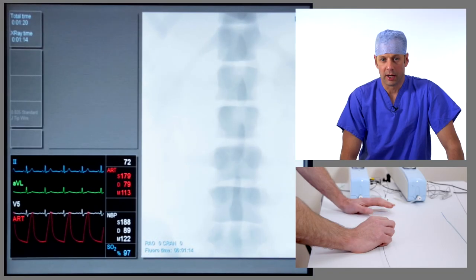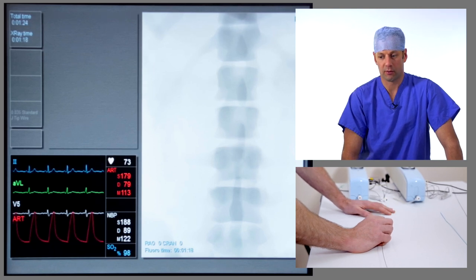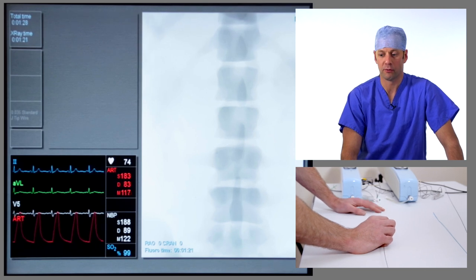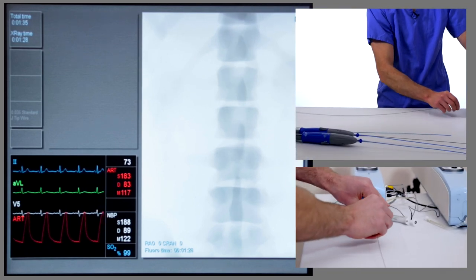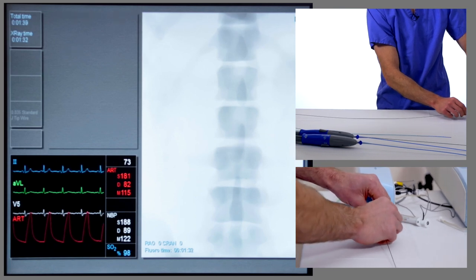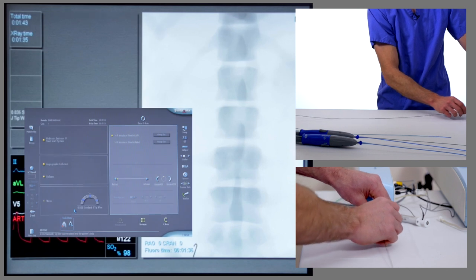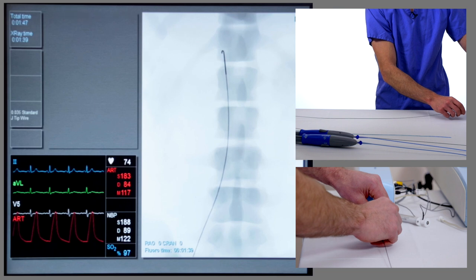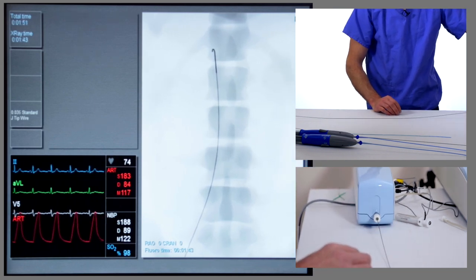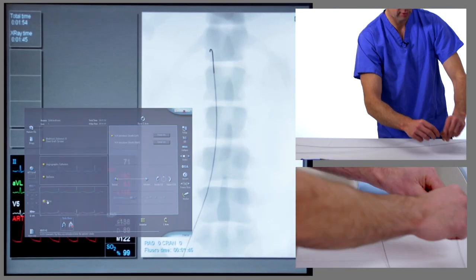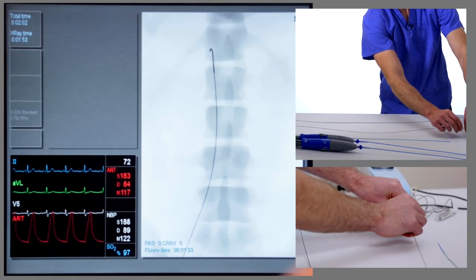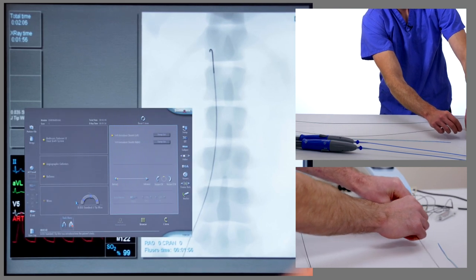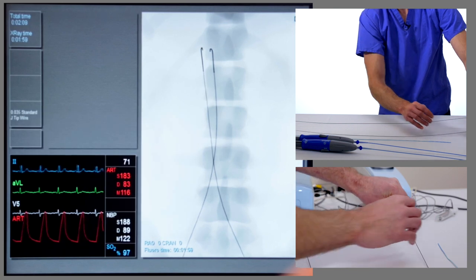We have a CT of the aneurysm and a 3D reconstruction. We're now going to deploy a Medtronic Endurant II stent graft into this aneurysm. We're going to start off by putting standard J-tip wires into both groins, starting with the right side. We'll park the tip in the abdominal aorta and put a similar wire up the left hand side. So we have safe bilateral femoral access.